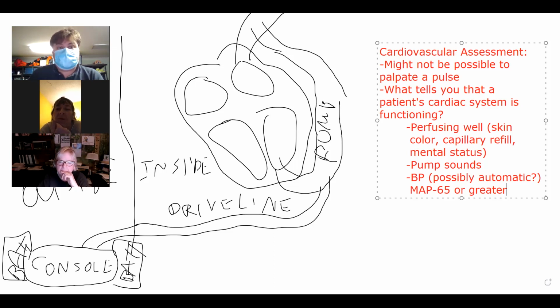I would in general say that because this is a ventricular assist device, and someone's pressure is very sensitive, you're probably not going to run into that situation, because I imagine there are some contraindications to nitroglycerin that a provider may hesitate to allow someone with a VAD to use it.